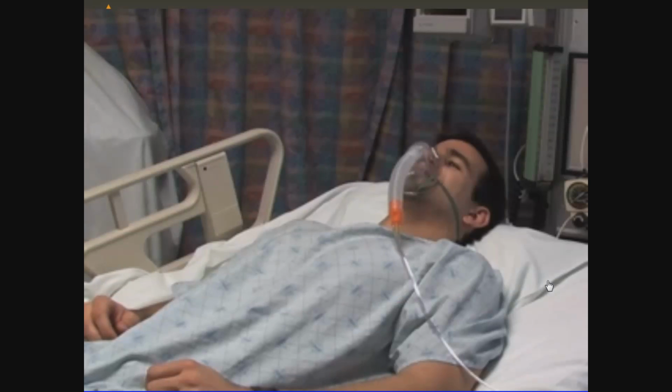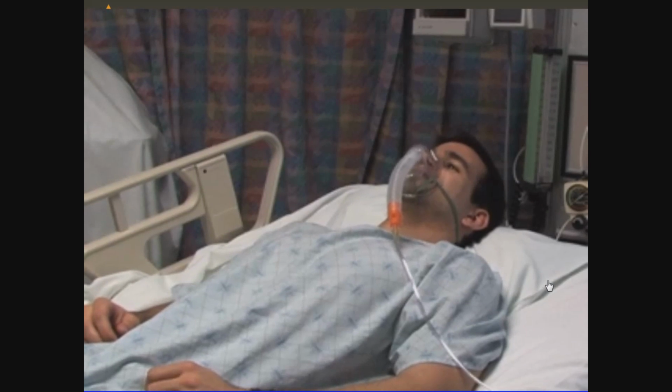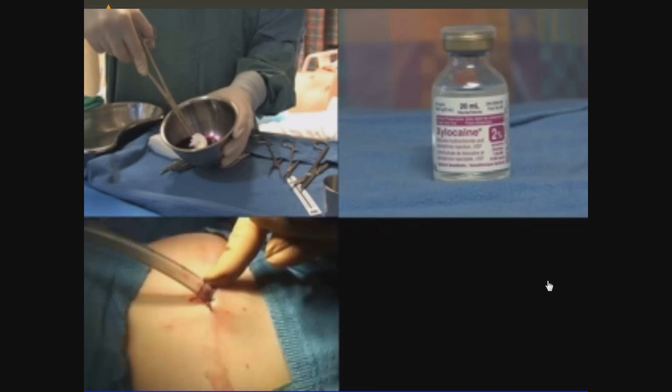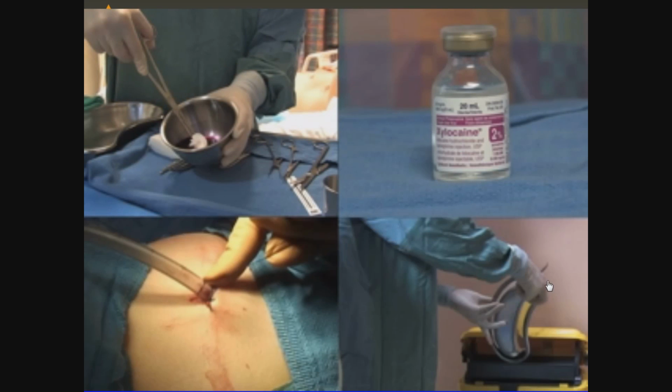Insertion of a pleural chest tube is often done in a setting where action is required. Nonetheless, adherence to sterility, analgesia, sound technique, and safety are always warranted.